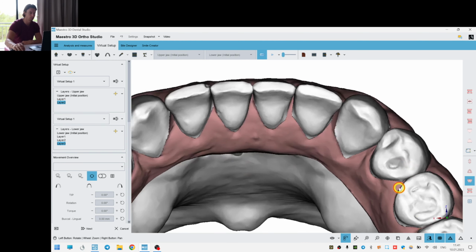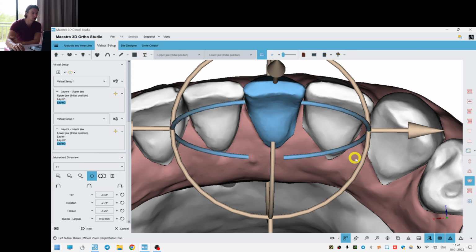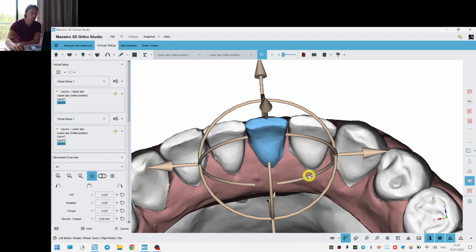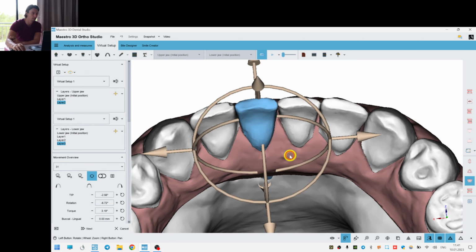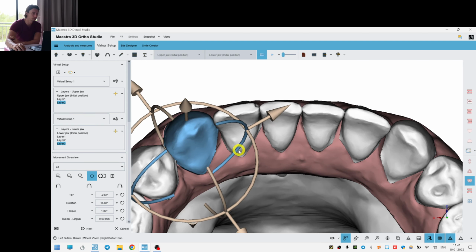Let's turn the gingiva on and check the overcorrection. So here we see that the central incisor on the right side, it was more labially. Now we should put it more lingually to get some overcorrection. And the same for the rest of the teeth. I thought that the IPR would be bigger in this case, but now I think it's not that big. Maybe 0.2, 0.3 millimeters between the teeth.